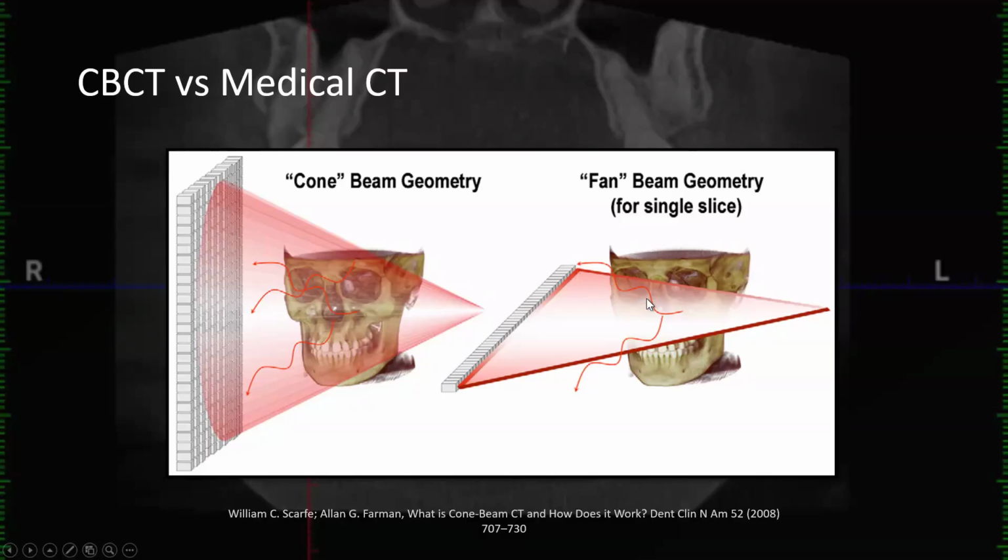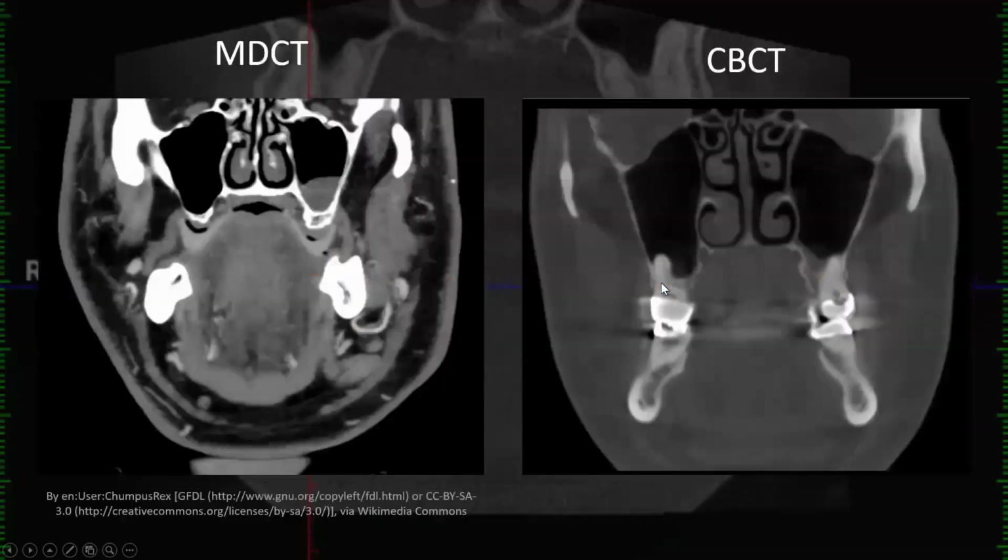I would say it takes longer, but with these medical CTs, they spin so fast, it's still just a matter of seconds with a medical CT before it's done. And so that's one advantage of medical CT, and that's one reason that they have better soft tissue contrast. When we're talking about seeing contrast in low contrasting structures, noise plays a big part of that. But I would say another thing, if you just look at the sheer mAs, just look at the mA of a medical CT, and it's a lot higher than your cone beam CT. And so they're just exposing the patient to a lot greater dose. And that's another big reason why there's better soft tissue contrast on a medical CT.